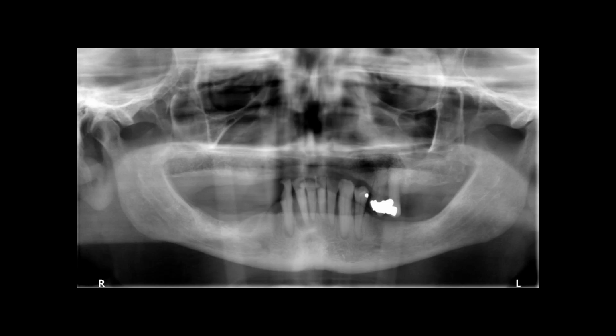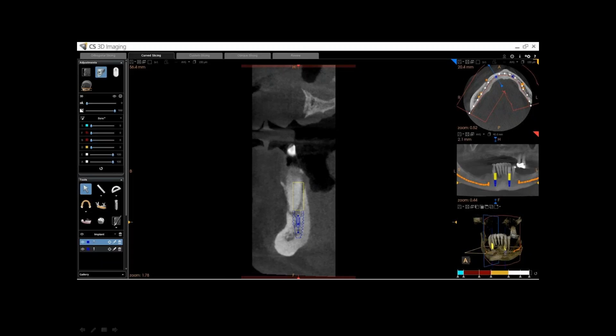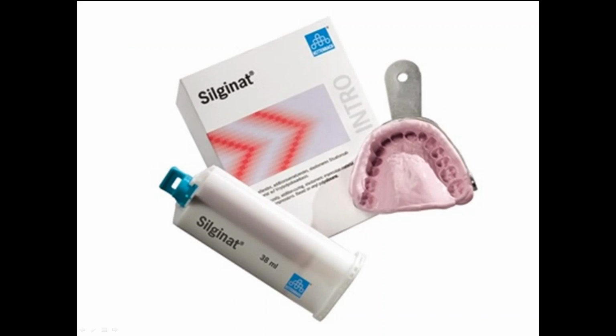to premolar region. Although we were still going to freehand this, the beauty with the Carestream software is that I could 3-dimensionally plan where our goal was to place these implants, as you can see in the cross-sectional views, and be able to maintain some of the ridge and graft some of the other parts of the ridge.